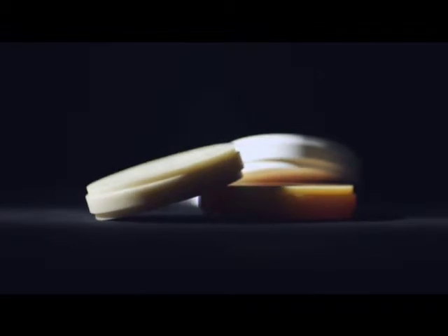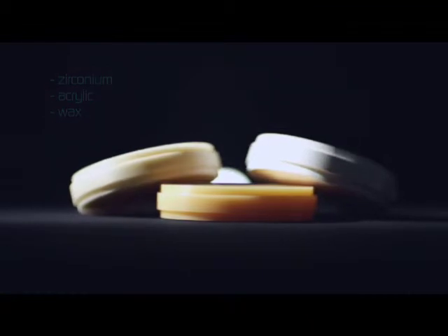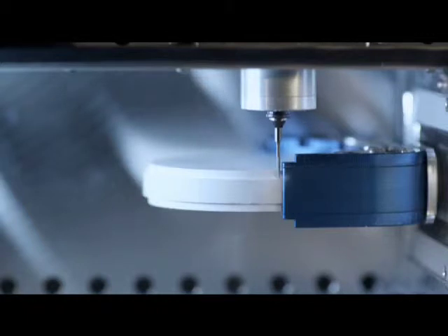The Shera EcoMill processes high-quality blanks made of zirconium, acrylic or wax. Fast, quiet and exact.